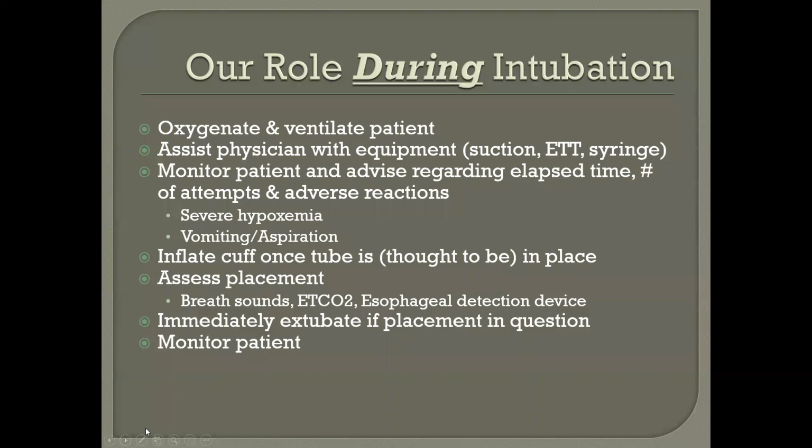I will tell you, things like fogging in the tube, there are papers published on this. I've had therapists over my shoulder saying, "Oh no, the tube is fogging up," and it was, whatever. But fogging in the tube is typically not a good indicator, certainly not conclusive. Again, immediately extubate if placement is in question.